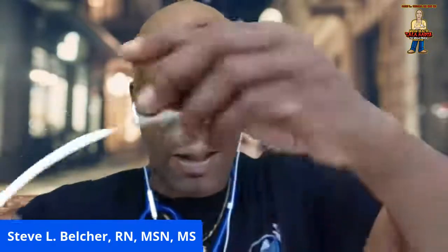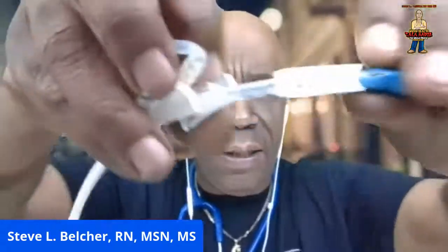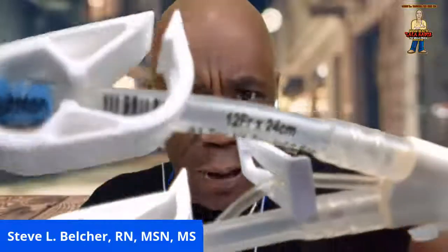Now, what can be done to remove the blockage from my catheter? And as I mentioned to you guys, with this catheter, what can be done? We administer medicine in each limb, right? There's some numbers on here. I want to see if you guys can see it. You see those numbers? Wait a minute, let me turn it upside down. I'm sorry. All right. You see those numbers?